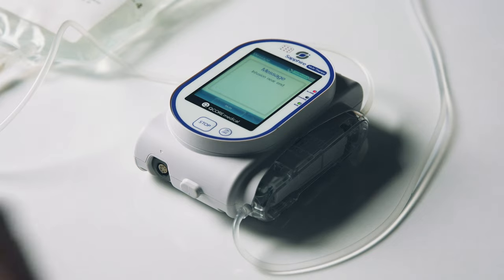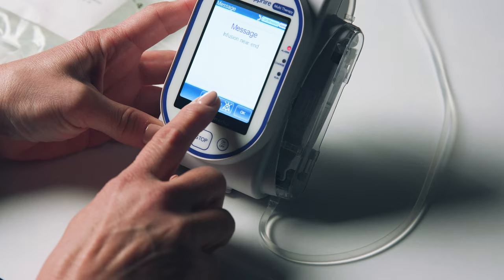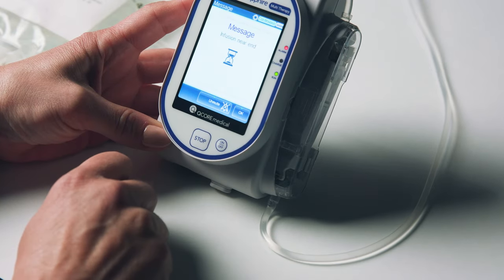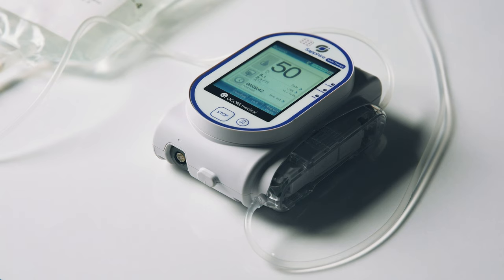Should an alarm display during your infusion, you must press MUTE at the bottom of the screen before clearing the alarm. After the cause of the alarm is corrected, press OK to dismiss it. Then press REQUEST CONTINUE followed by OK to resume your infusion.